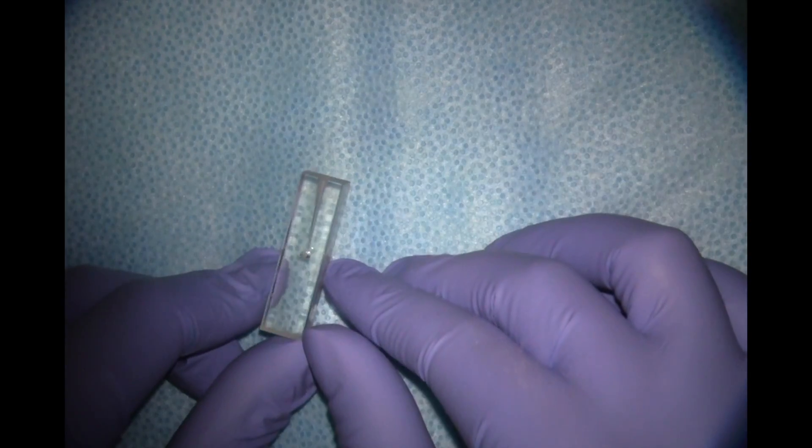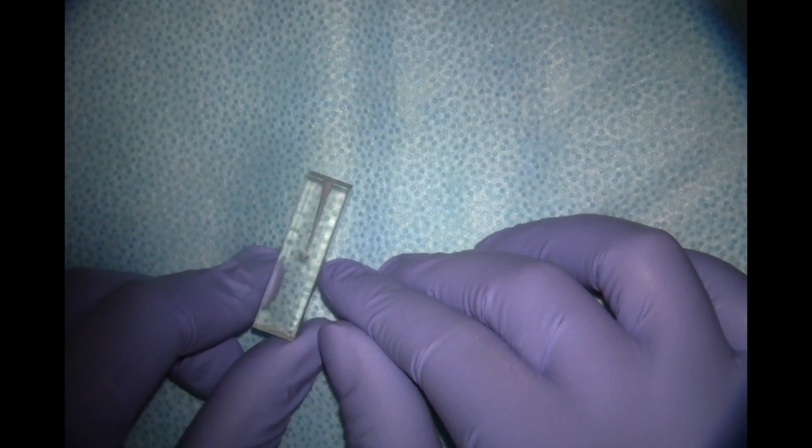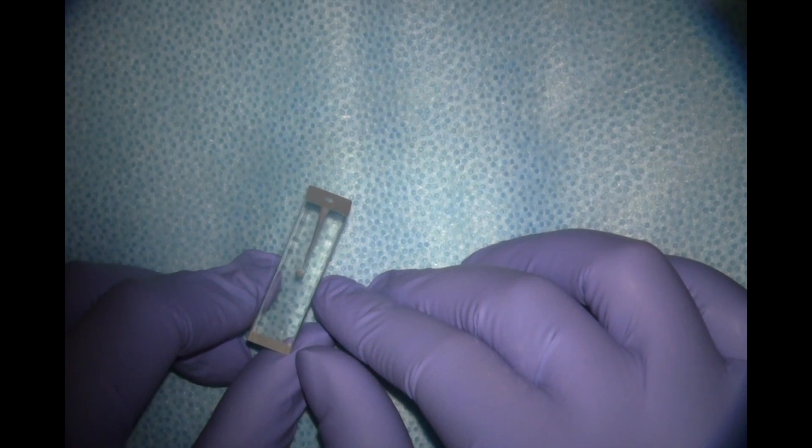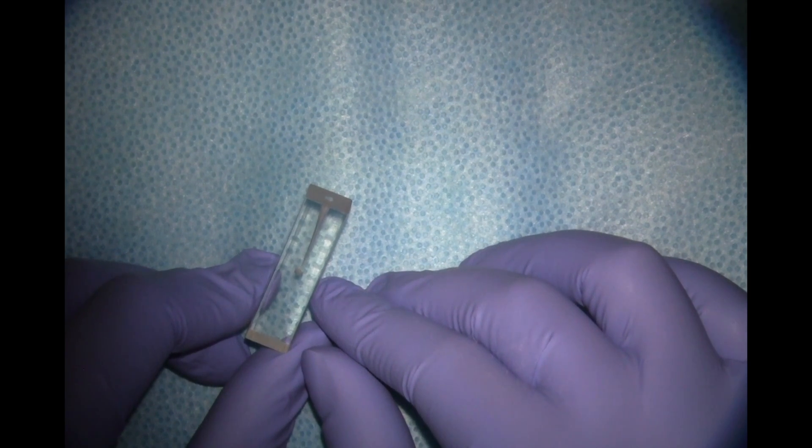This is a quick demo of the cold lateral obturation technique that we're going to be using in pre-clinic and in the clinic. I've instrumented this plastic block with our step-back technique. My MAF is a 30 and my corrected working length on this block is 16.